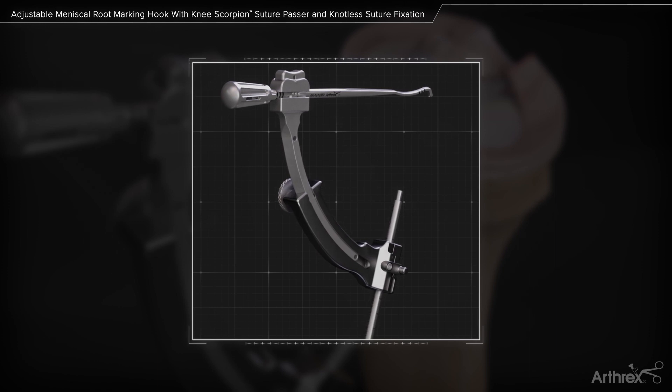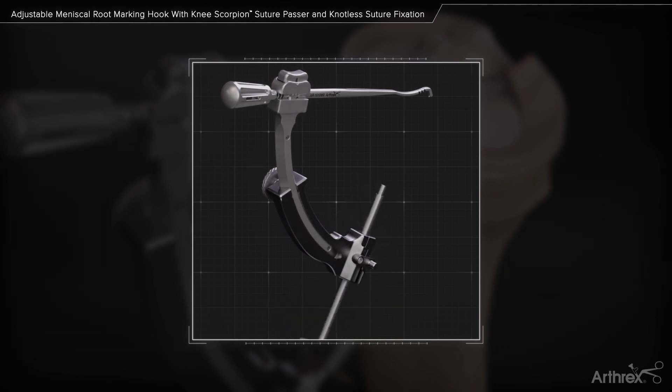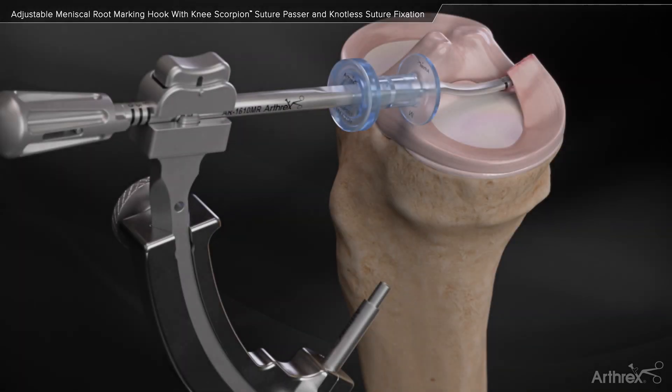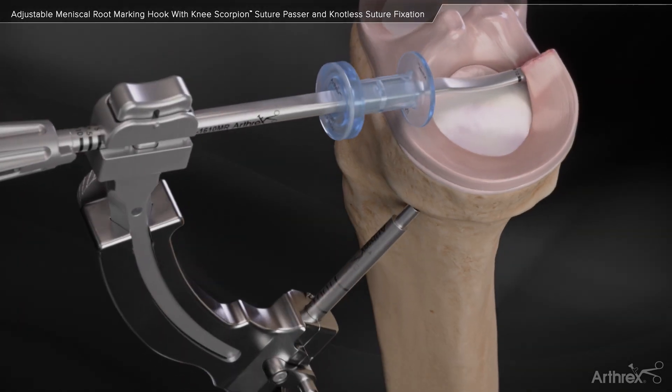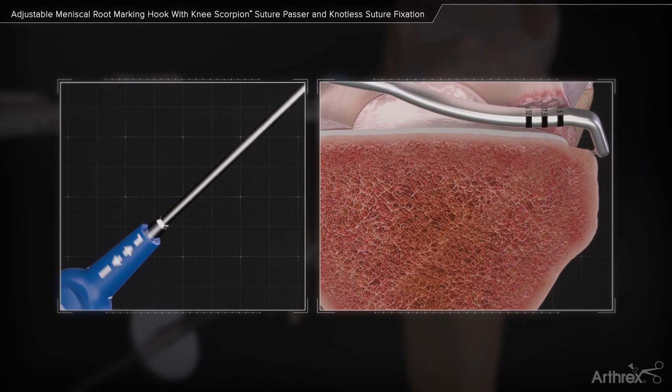After positioning the marking hook on the tibia, the guide can be rotated for optimal drilling without disengaging the hook. Advance it to the desired entry point. Using a six millimeter flip cutter, drill forward to the tibial plateau.